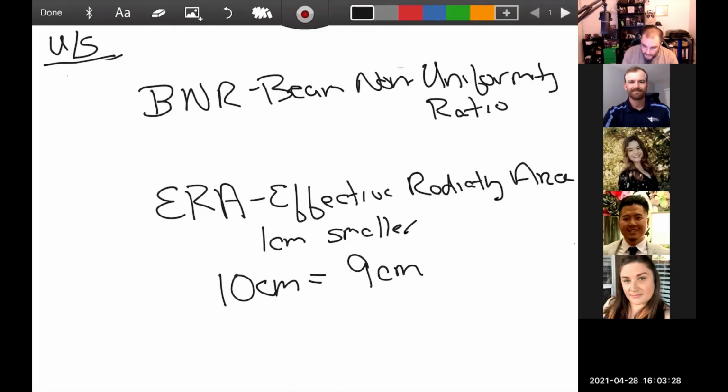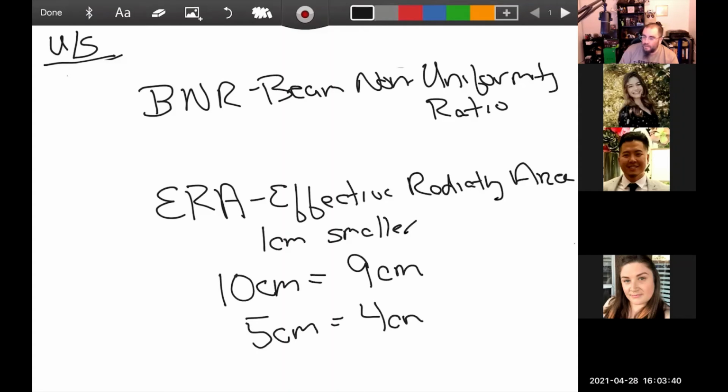We also have a 5-centimeter sound head. What do you think the ERA on that is? 4? Yeah, 4 centimeters. So what does that mean? Well, your ERA is going to determine the area you're treating. So do you remember how ERA affects it? Well, the ERA, you're going to treat 2 to 3 times your ERA.